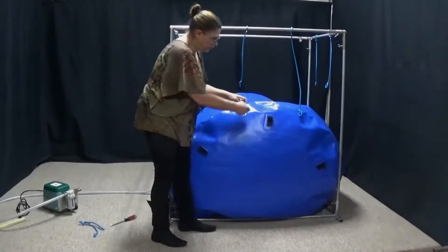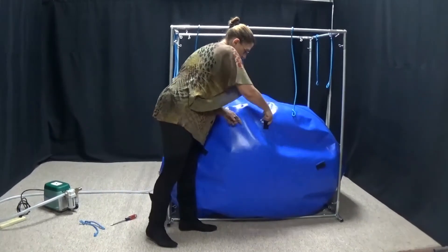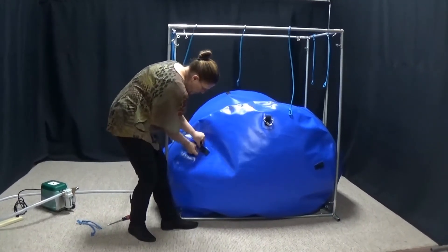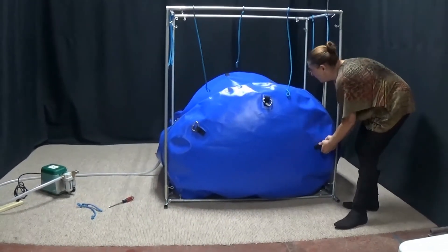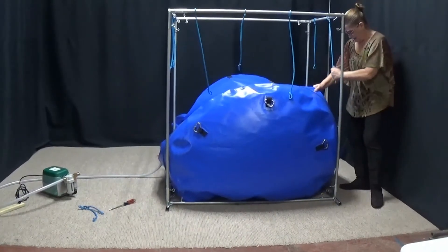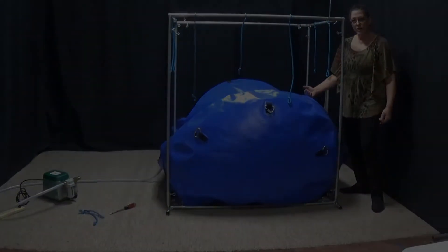And then we have three here in the front — one, two, and three. I don't really want to connect my bungees yet because this is pretty heavy and they really don't reach yet. So we're going to continue inflating and then we'll connect all of the bungees.